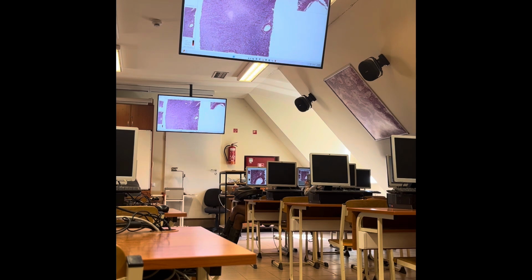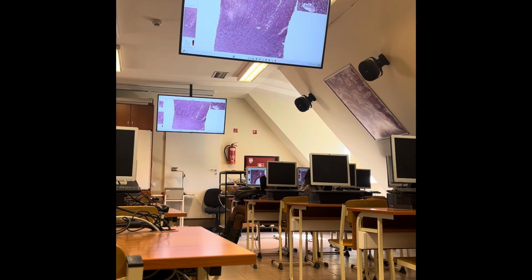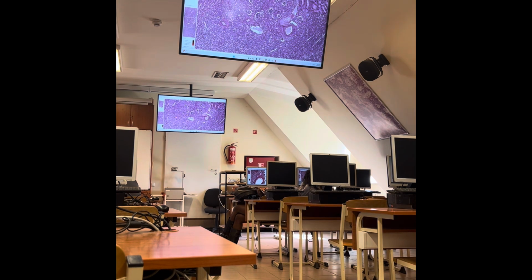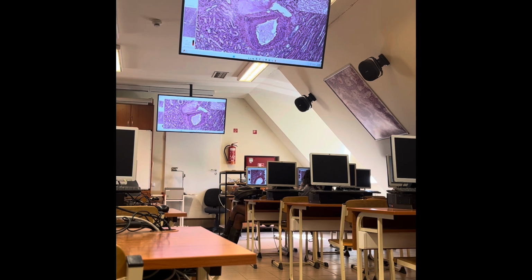A vein is actually traveling parallel with the artery, but it is not visible in our section. Then they will make a turn at the border of the cortex and the medulla, and the next segment of these vessels is the arcuate vessels, if you remember.